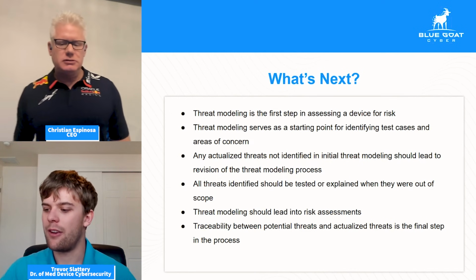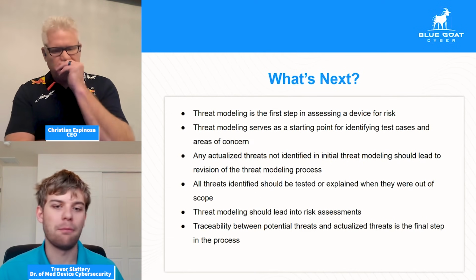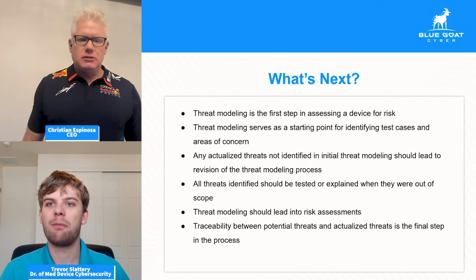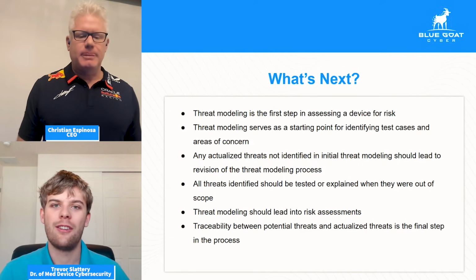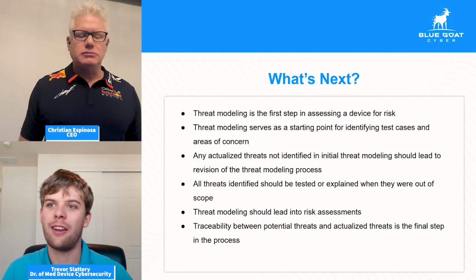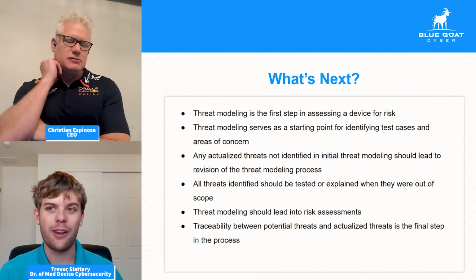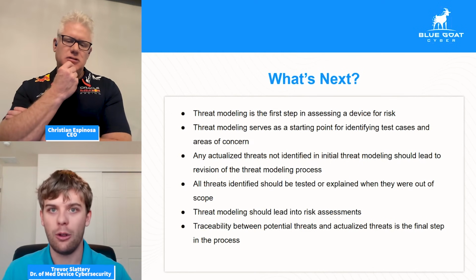Yeah, and that's a good point as far as the development process, since designing security into a system is not easy. Any part of a development process is difficult. Creating a secure product is even more difficult. Oftentimes, there needs to be a balance between functionality and security. In a perfect world, security consultants and security experts are going to say everyone needs to have mandatory two-factor authentication and their password needs to be 30 characters long. And we say that to a developer and they go, well, we can't tell our users to use a 30 character long password because they're going to get annoyed. They won't want to use the product. We need to find the middle ground.